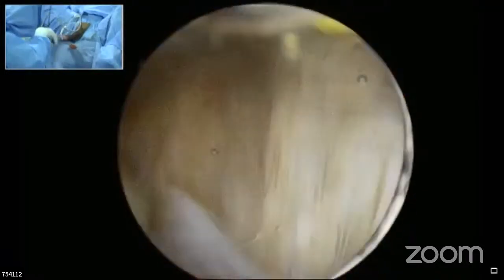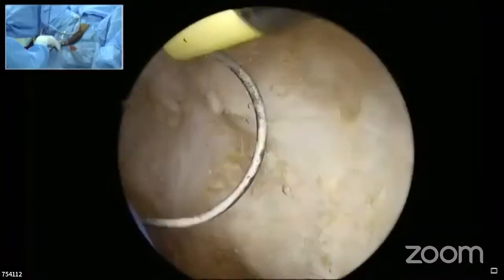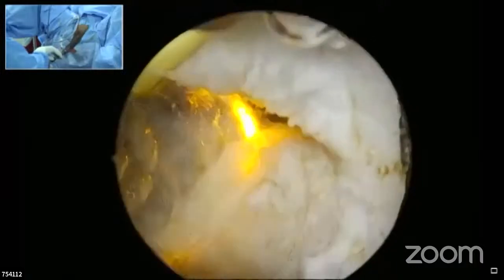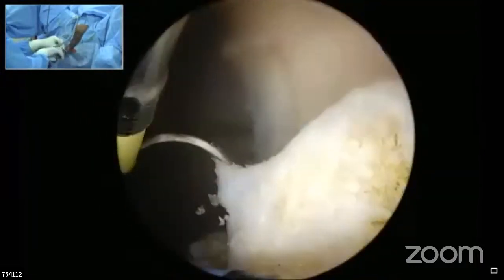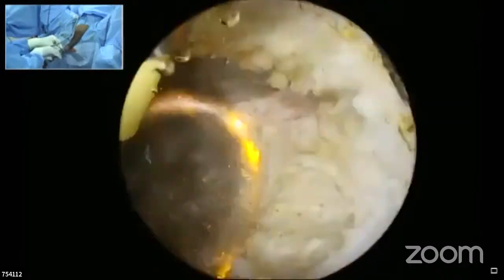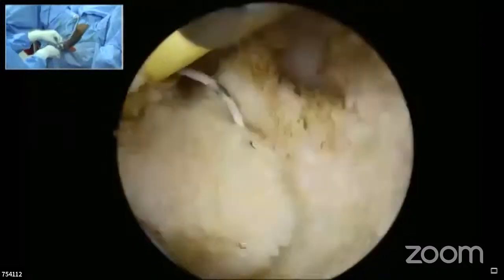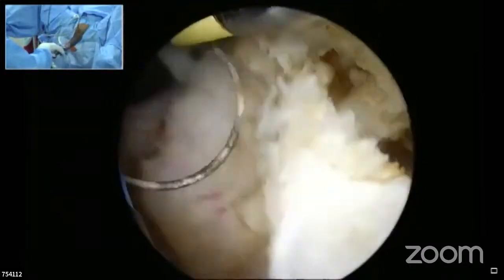One of the doctors has asked that he has an Olympus bipolar, but he has noticed a lot of bubbling. He's asking, is there a role of the temperature of the irrigating fluid in this bubbling? Bubbling is the effect of corona formation. That bubble is a mandatory thing, as the corona collapses into bubbles, and the bubble is always there. That's the negative point of a bipolar.